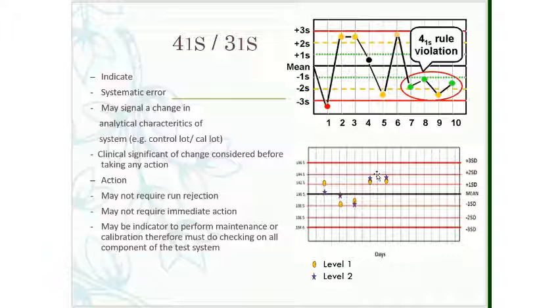And please note that for 3 levels of QC, 3 levels of control, it uses the 3-1S rule. It can mean in one run, all the QCs are on the same side and between 1 to 2 SD. Shown in this example.